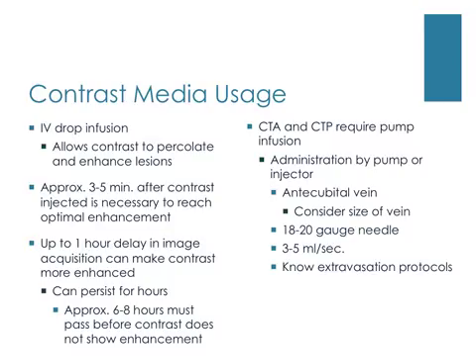Because enhancement persists for hours, at least 6 to 8 hours should elapse after a contrast scan before an unenhanced CT brain is performed. This will confirm that the enhancement is real and not the result of calcification or hematoma.